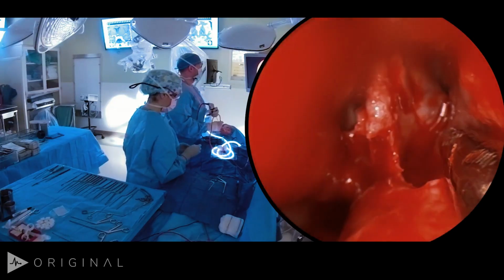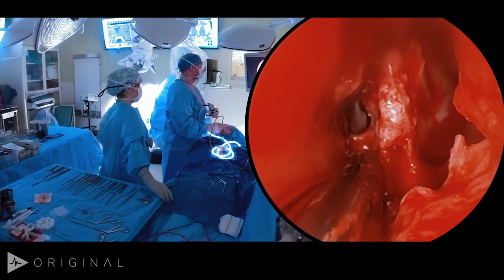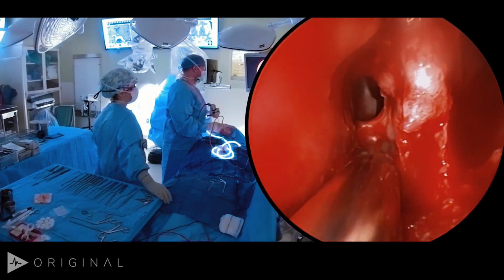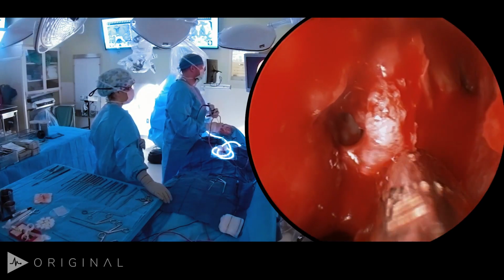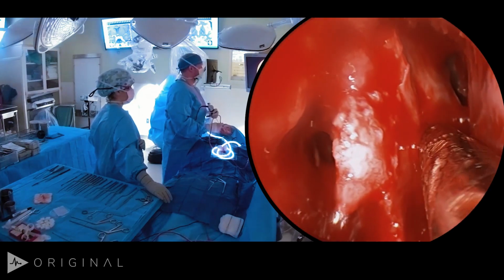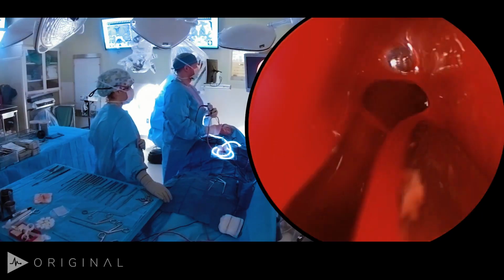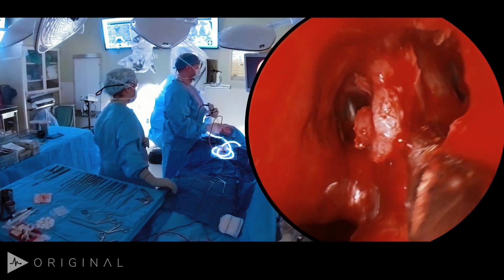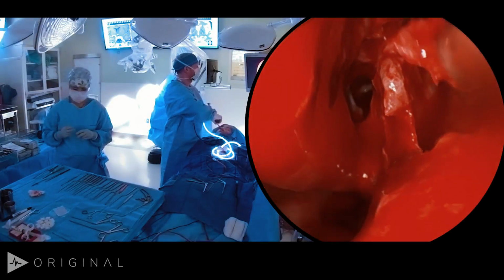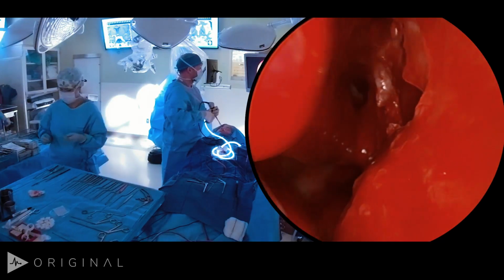So just to kind of recap and reorient, that's the contralateral sphenoid os. This is our ipsilateral one. So we started with our exposure on the right. We've swept down some of the mucosa here on this side off the septum. We have some of the posterior vomer here, which is going to attach to the sphenoid rostrum. So now we're going to take a kerrison and make a connection superiorly here. And the goal of this is just to free up this rostrum as much as possible so that when we go to fracture it and take it out, it's free.